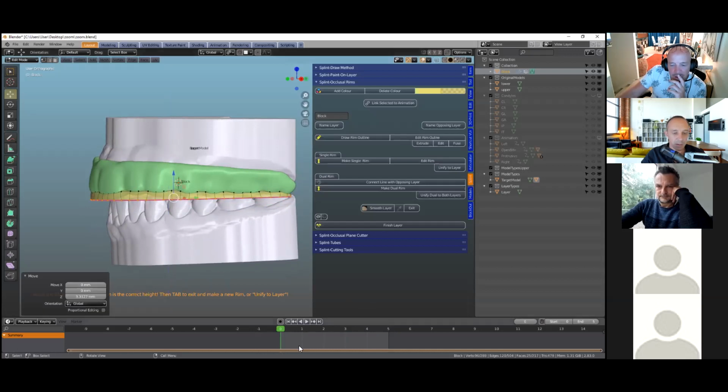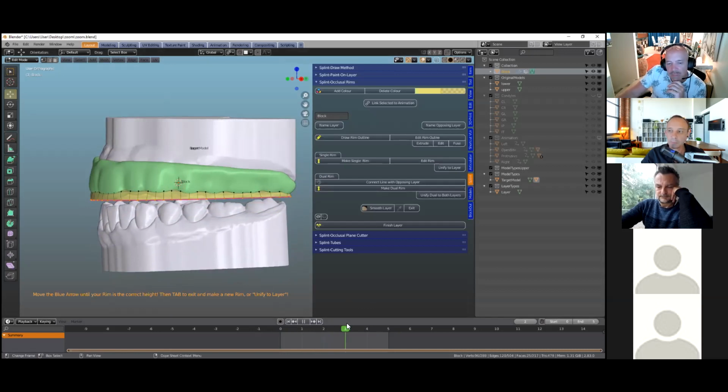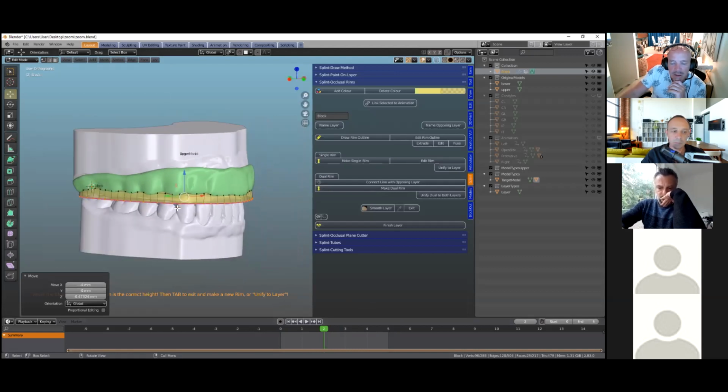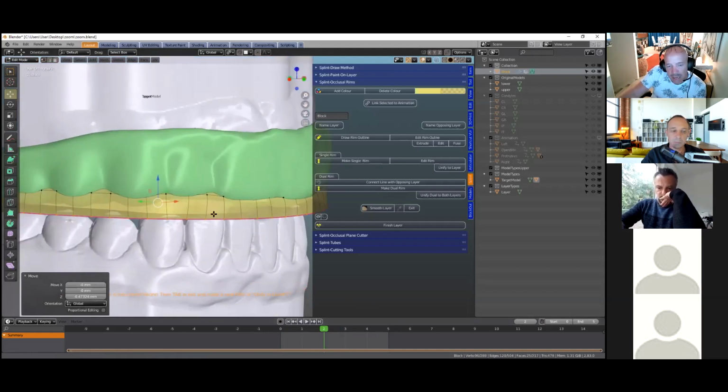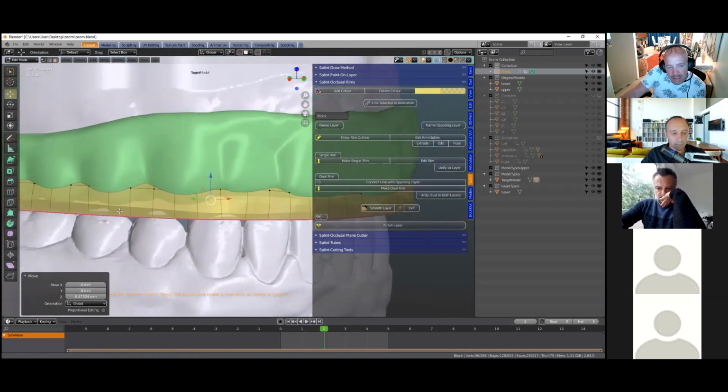I would probably say the early stages, like maybe 1 or 2. Initially I thought 3, but 3 is a little bit deep, I found, and I think other users may have found that as well. It is transparent yellow, so we can actually see the tips going through the teeth.